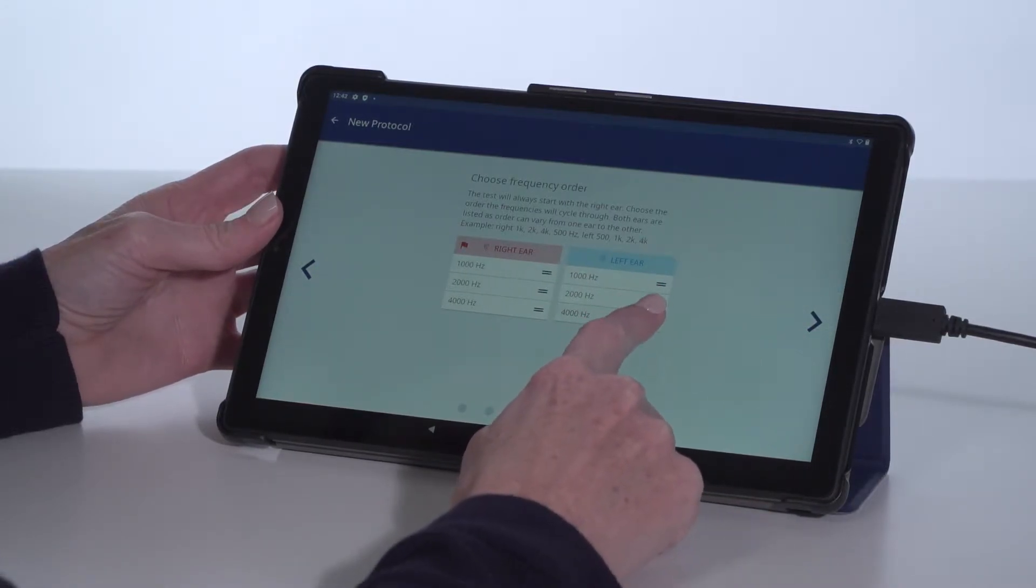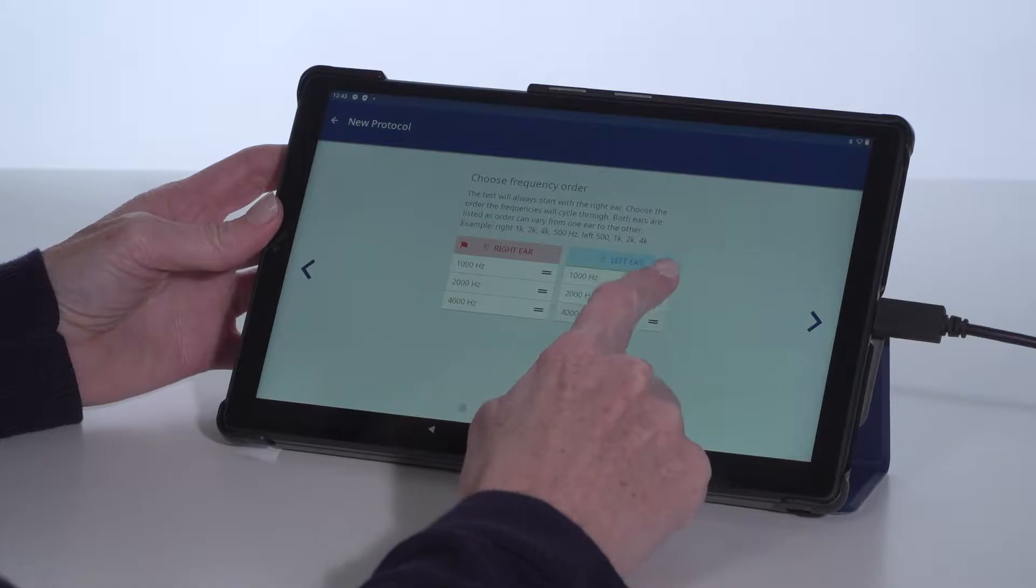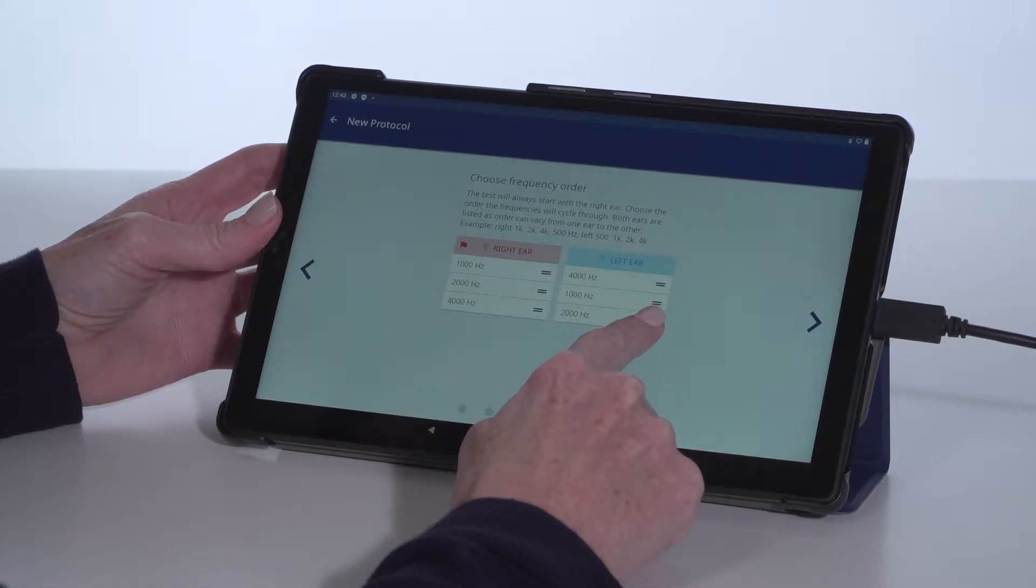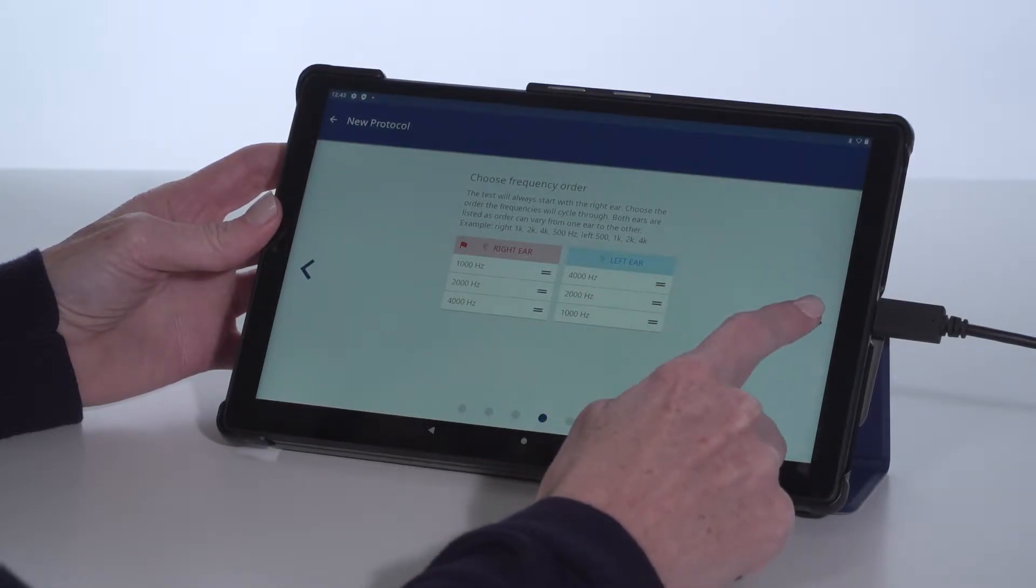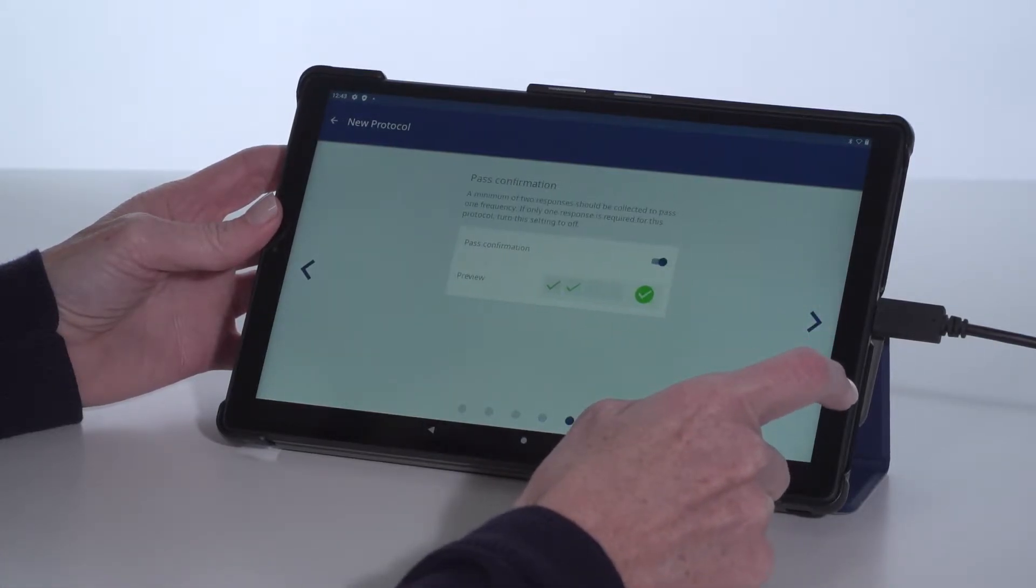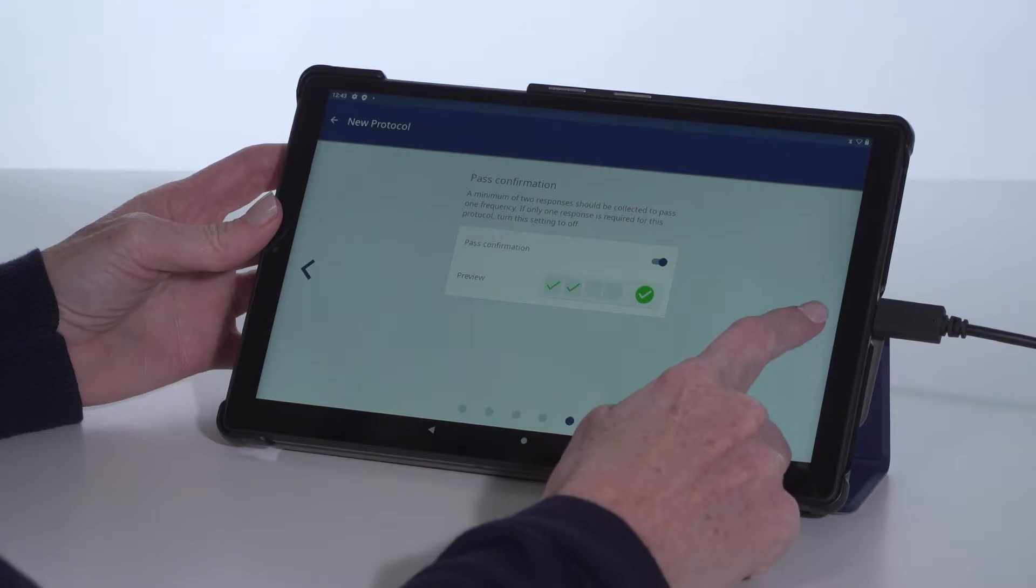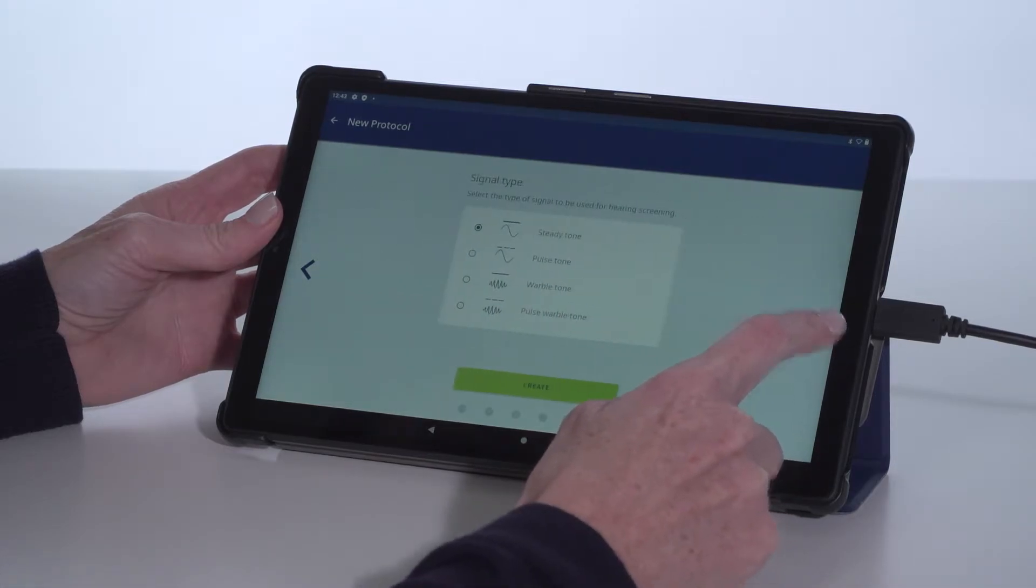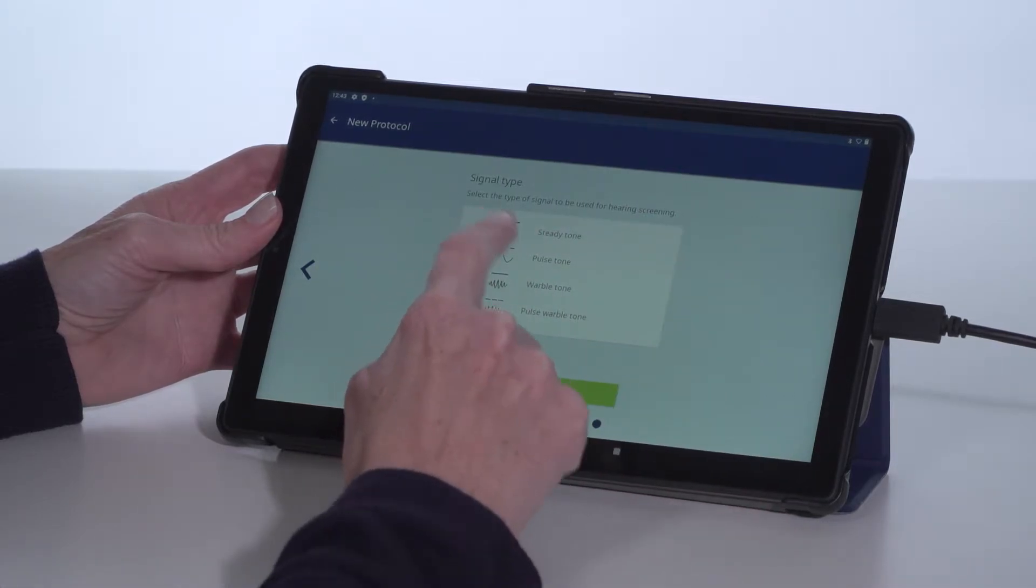Setting this up will lessen screening time and allow semi-automatic operation for the app to guide the screener and also provide location specific pass refer criteria.